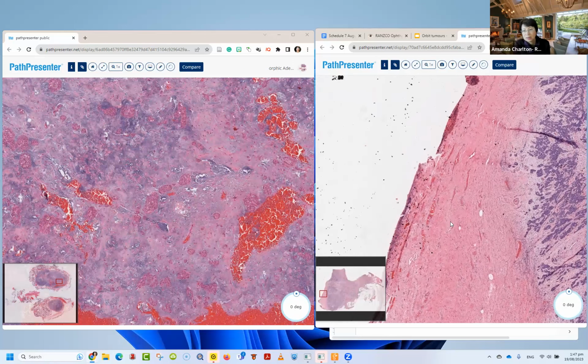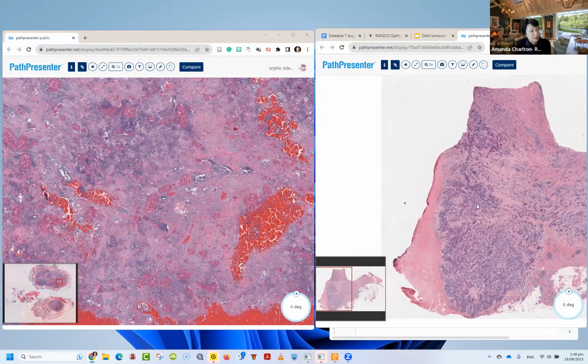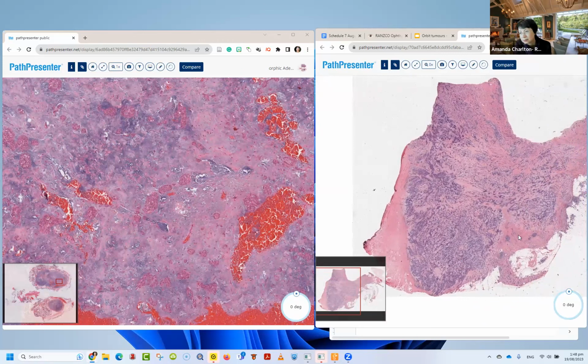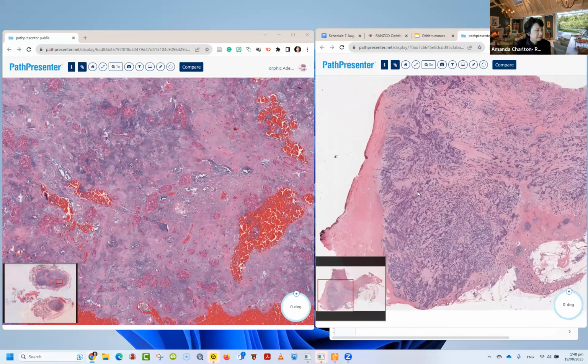So squamous epithelium here, it's occurred in a mucosa, and therefore there would have been a gland underneath the mucosa, deep to the mucosa, from which this tumor has arisen. So this is how I'm approaching this tissue. So it's a squamous mucosa, and we know there's squamous mucosas all over our body, including oral, genital, respiratory, lots of different mucosas.